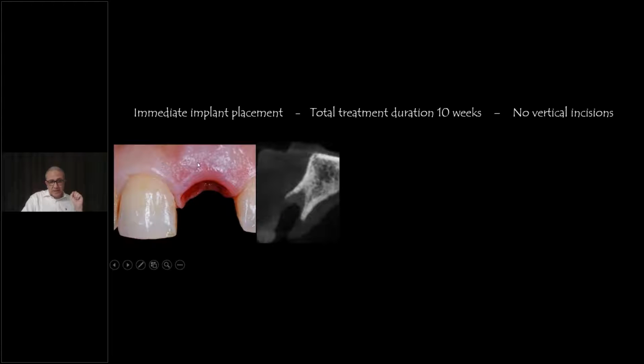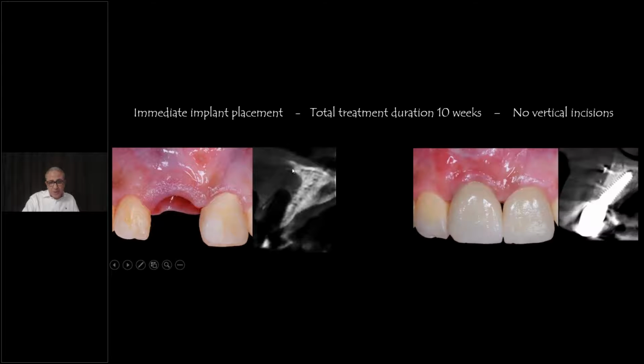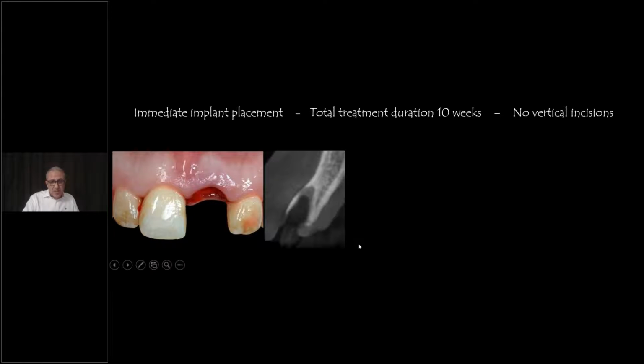Same thing with deficient labial plate bone. This is a 2-year follow-up with 10 weeks of treatment duration just to get there. Same thing. Complete loss of the labial plate bone, full regeneration of the labial plate bone with a flapless approach, no vertical incisions.